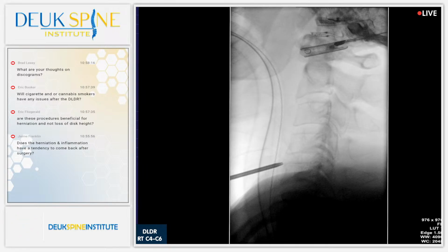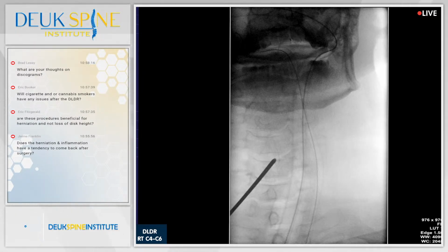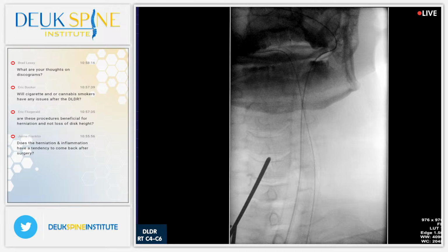All right, so I'm really happy on the lateral view. Let's see if we're still in the middle. I may have to make a left to right correction. Let's just see. 2, 3, 4, 5. All right, we're still pretty much in the middle. I can move a little bit to the middle, a little to his right. That's perfect. Now let's get a lateral, and that's perfect.